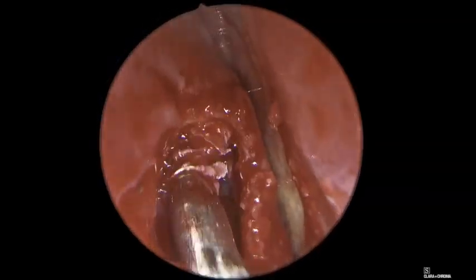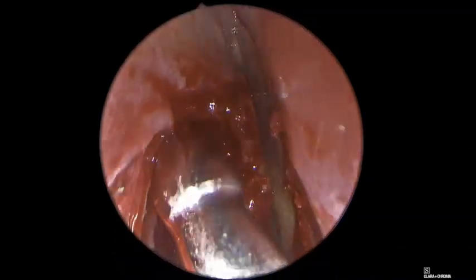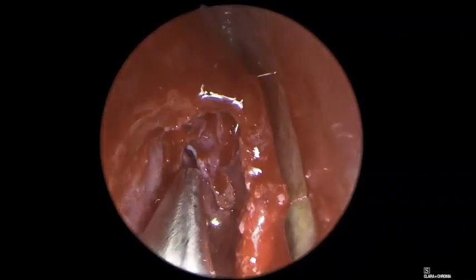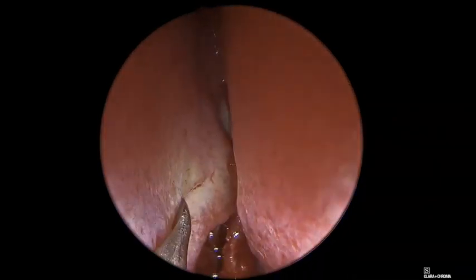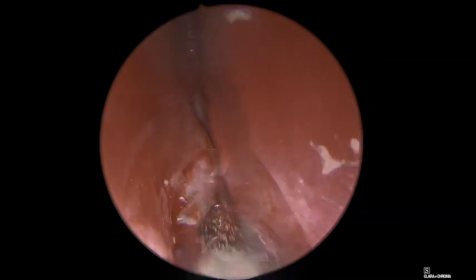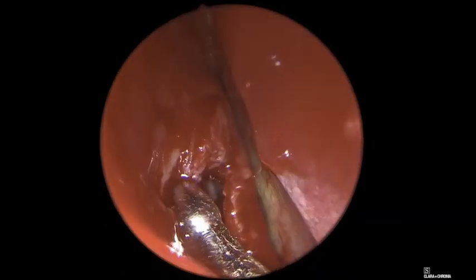On the other hand, the lacrimal bone is identified after performing the uncinectomy and agger nasi opening, confirming the close relationship between the cranial portion of the uncinate process and the lacrimal bone on the lateral nasal wall. Using a Cottle knife, a C-shaped mucosal flap of approximately 5 mm of thickness is removed from the frontal process of the maxillary bone, represented by the maxillary line.